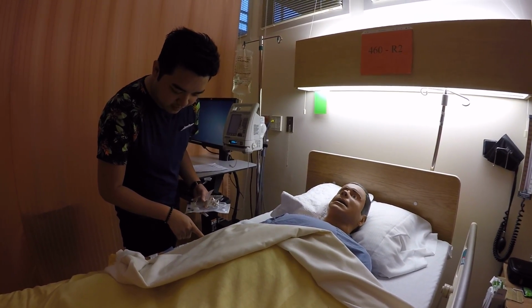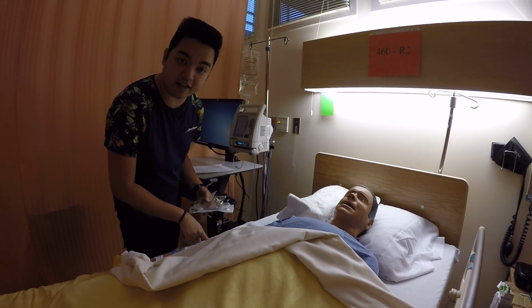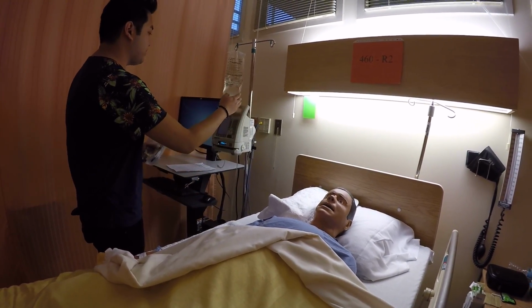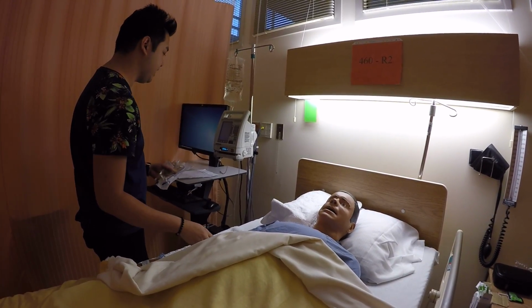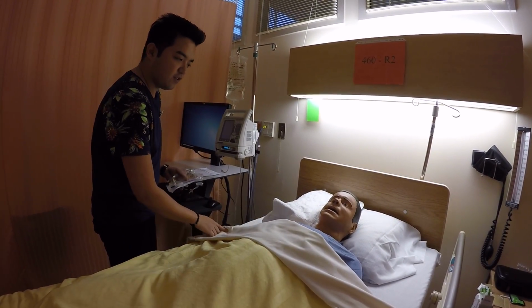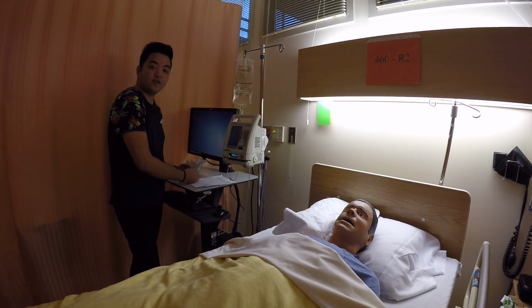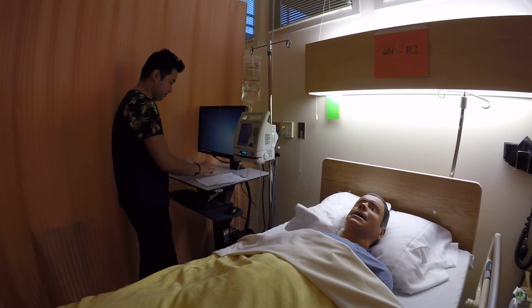So the IV site is okay. There's no redness, there's no inflammation. And, okay, the primary line is infusing properly. And then, thank you for that, Mrs. De La Cruz. So now, I'm just gonna prepare your medications, okay? Okay. So now, I'm ready to do my third checks.